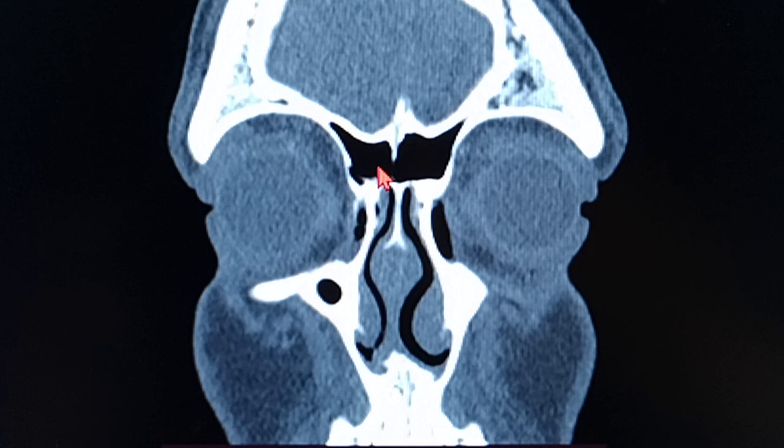I would call this the frontal sinus, but the most posterior aspect of the frontal sinus. And you can see over here, that's the brain. So if you are in the frontal sinus, if there's a frontal sinus mucocele or some kind of invasive fungal sinusitis or a traumatic case, you can have a dehiscence on this bone of the frontal sinus. You can have meningoencephalocele popping out from this area, which you then have to treat by combining your endonasal and the external frontal approach to have a CSF leak repair right here.